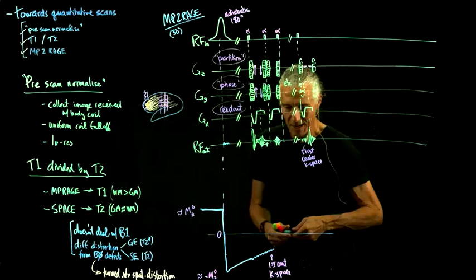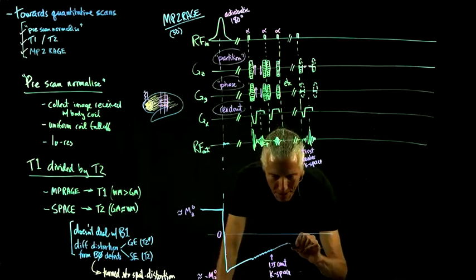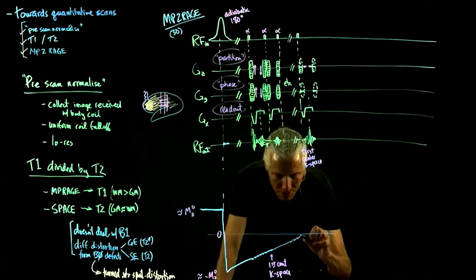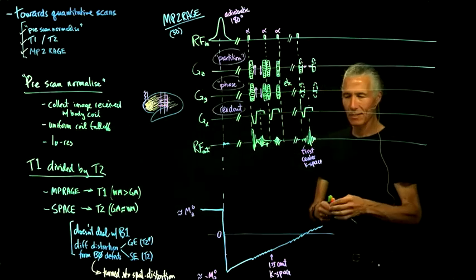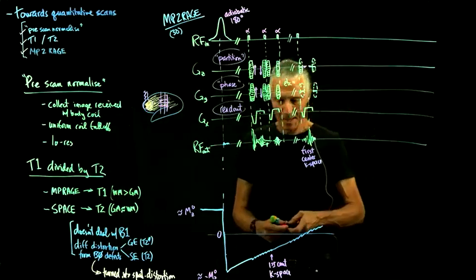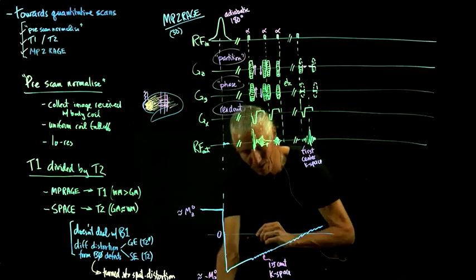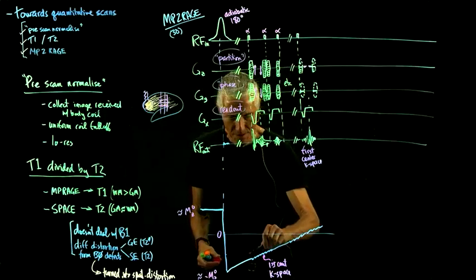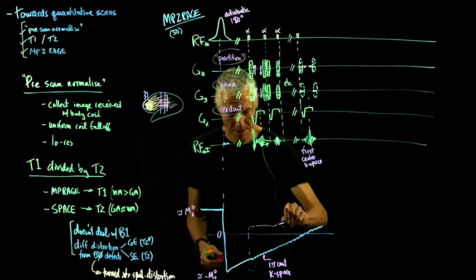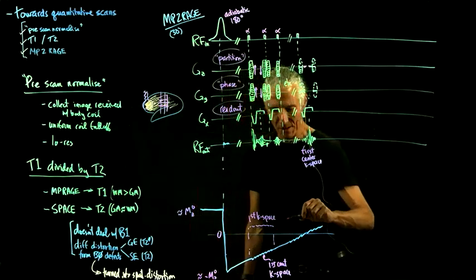But then what we do is we wait a little while and then do the whole thing again, and collect a whole another set of k-space data. Maybe make this one in the center here so it's kind of symmetrical. We recorded that one pretty early on. So basically this is our first k-space. We're collecting two complete k-spaces, like repeating. And then here's our second k-space.